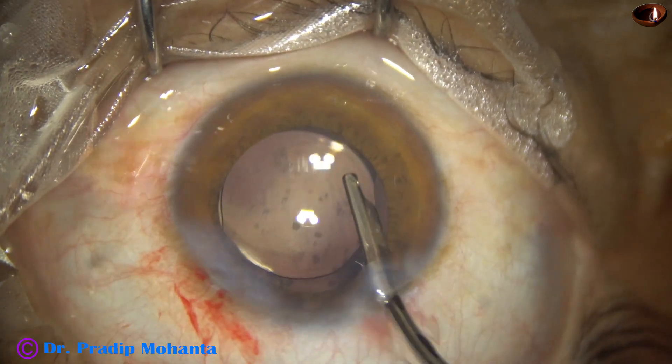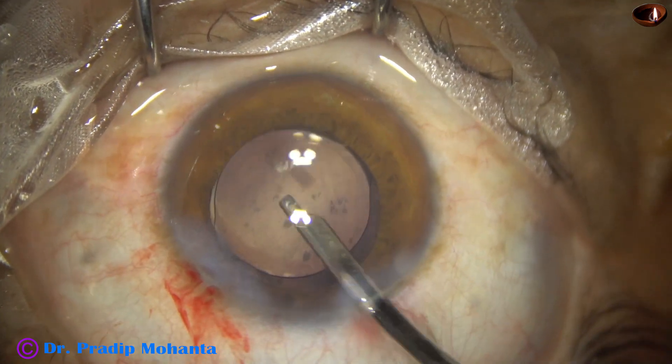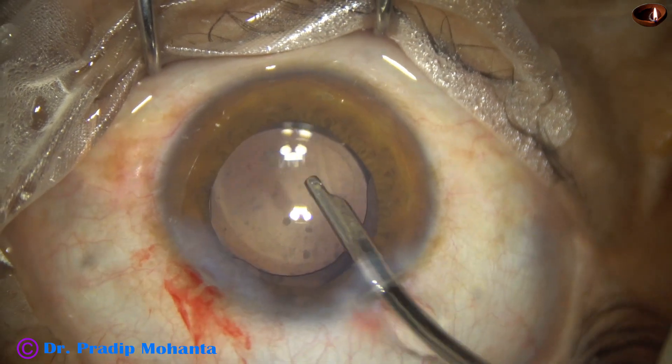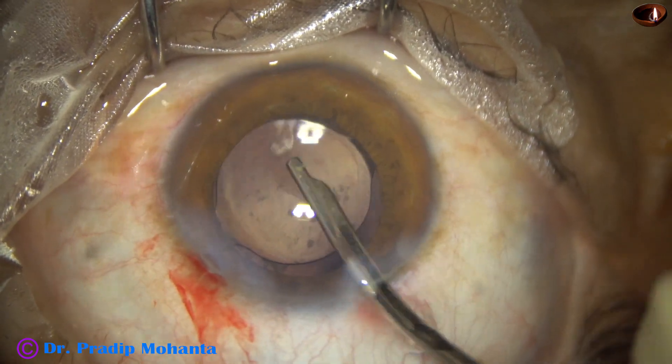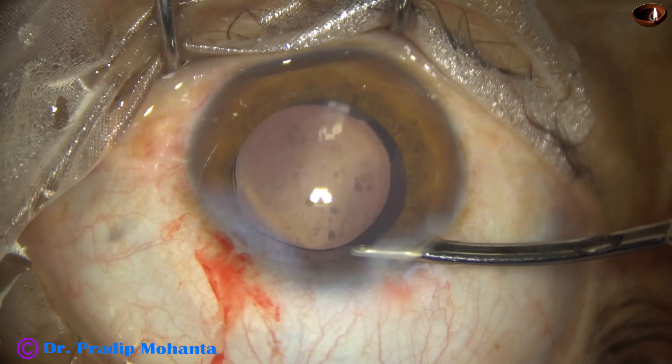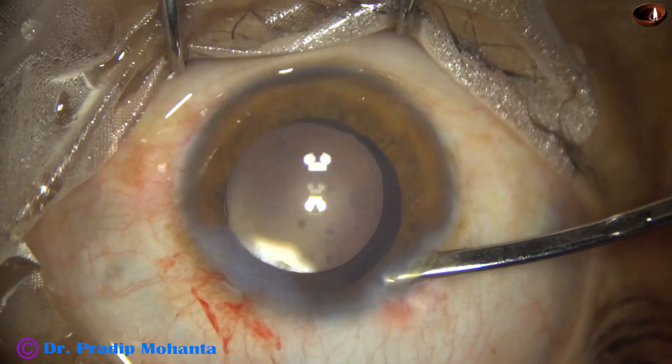Now visco is being removed. The side port has been closed by corneal stromal hydration. Final lavage of the anterior chamber is done. The anterior chamber is formed very nicely and the case is concluded.